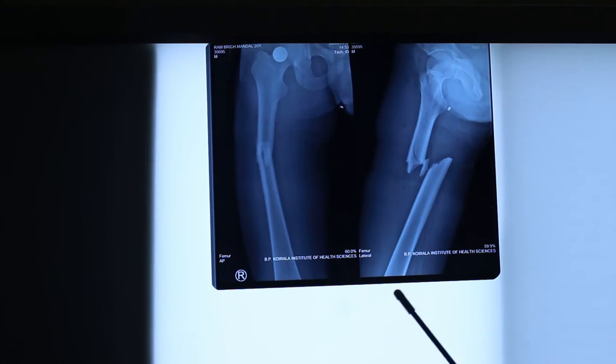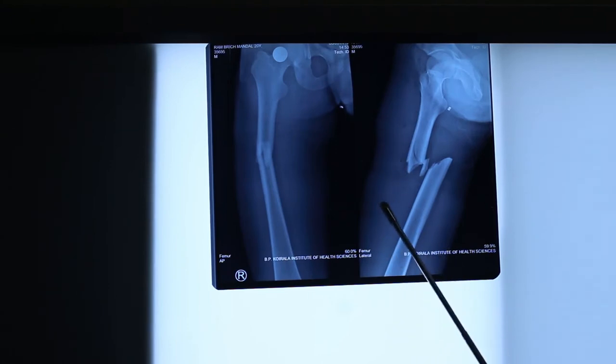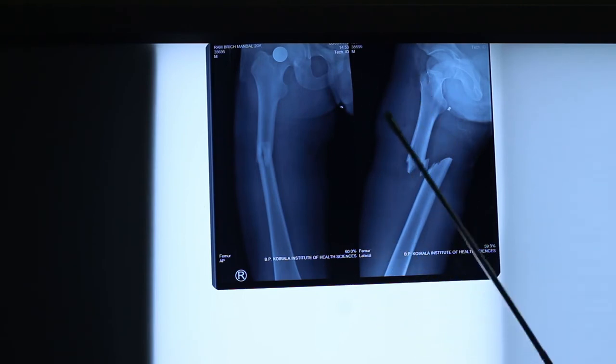Now I will put the other X-ray. These are the plain X-rays with adequate exposure with all the details visible here.